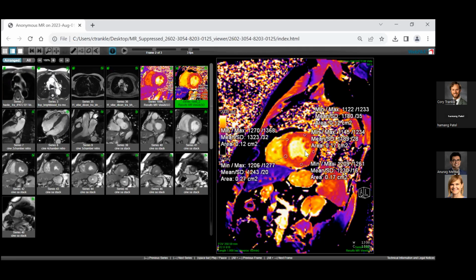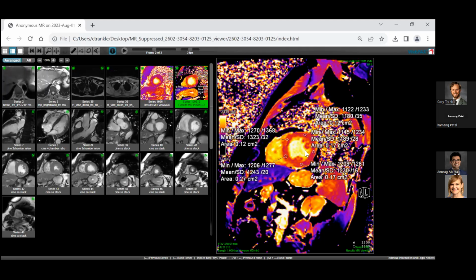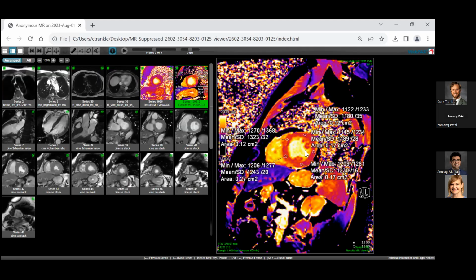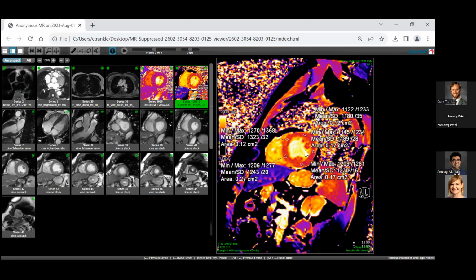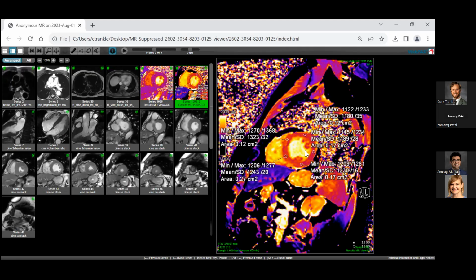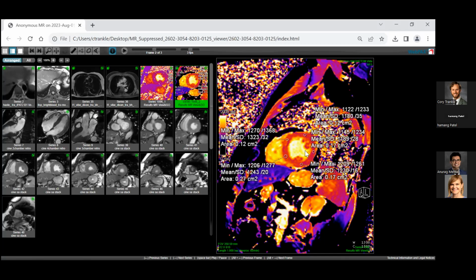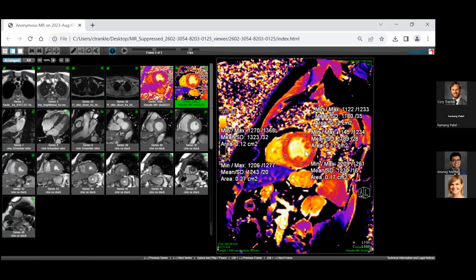But you want to keep in mind your T1, that unwinding, has a broad dynamic range. That's why we need a color map. And it's a non-specific measure. Something's wrong. Now, for this particular individual, most all of this is normal, right? So he has normal T2 and normal T1. That's very reassuring, depending upon the question that you're asking, okay? Everybody get that?